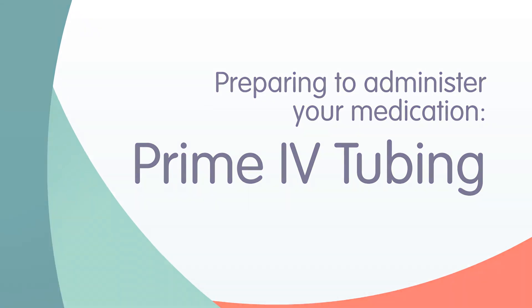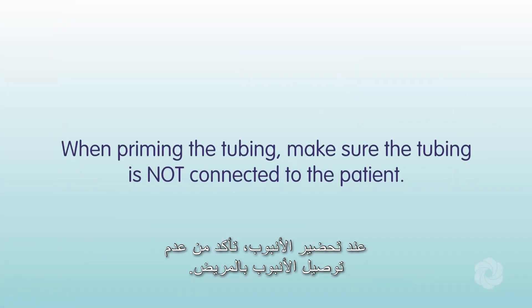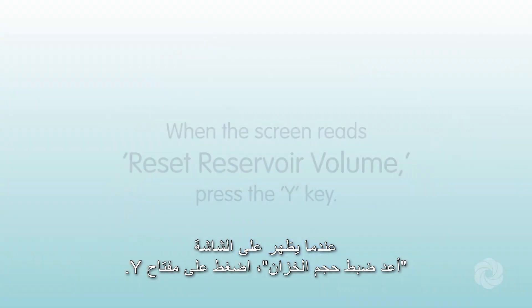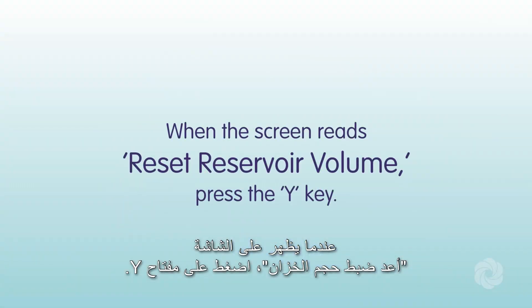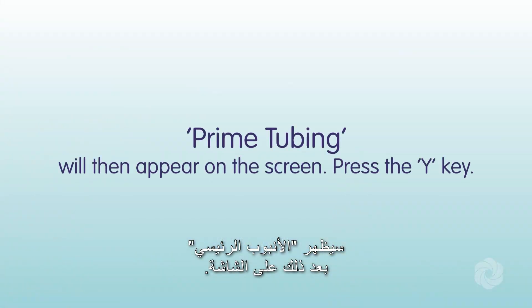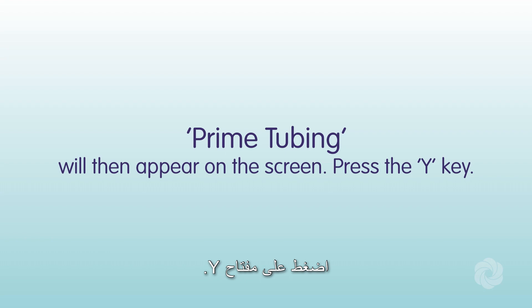You are now ready to prime your IV tubing. When priming, make sure the tubing is not connected to the patient. Press the next key. When the screen reads "reset reservoir volume," press the Y key. "Prime tubing" will then appear on the screen — press the Y key again.